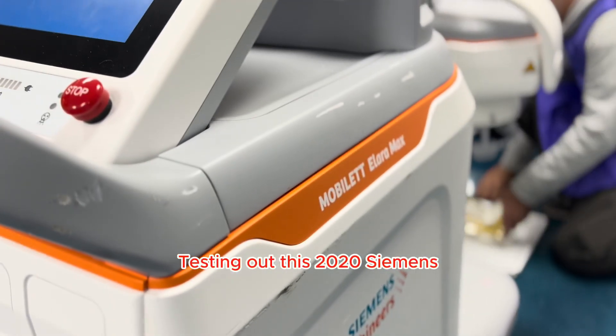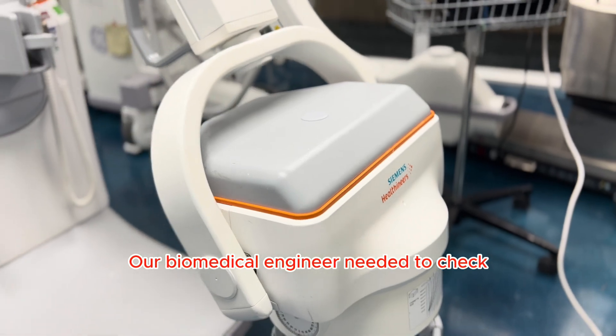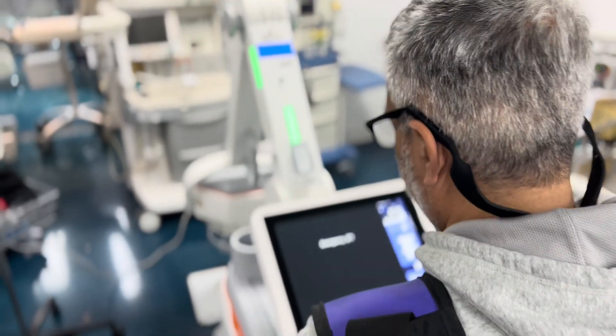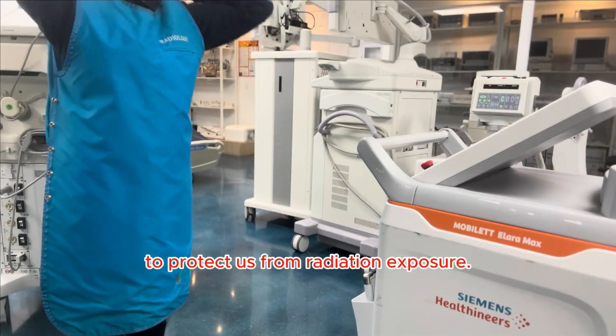Testing out this 2020 Siemens Mobilett Elara Max portable x-ray. Our biomedical engineer needed to check the system's functionality of this equipment for a client. So the first step was to put on our x-ray lead aprons to protect us from radiation exposure.